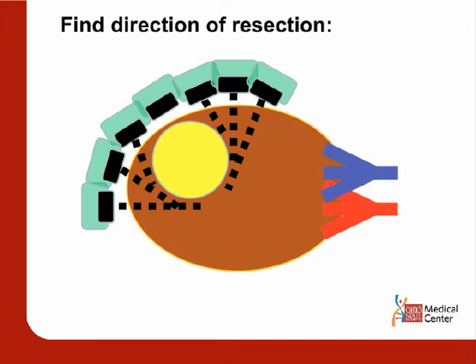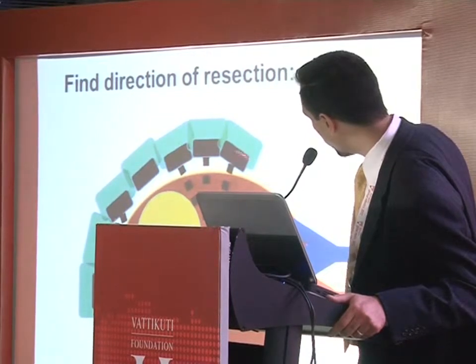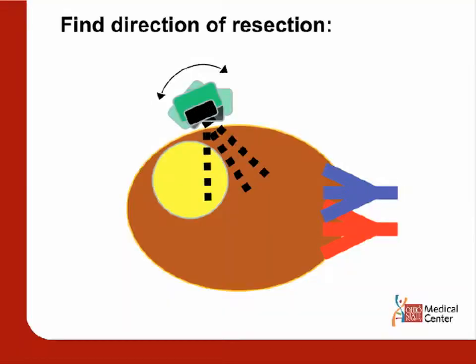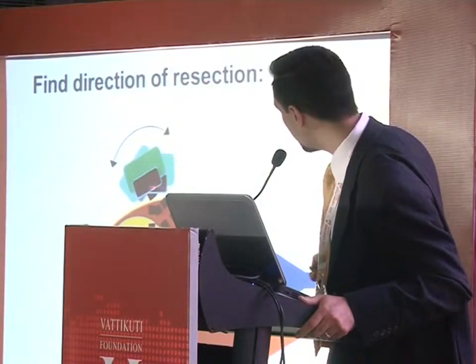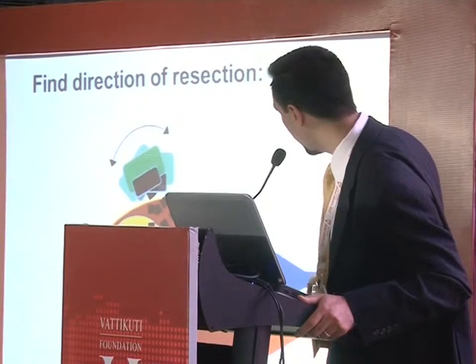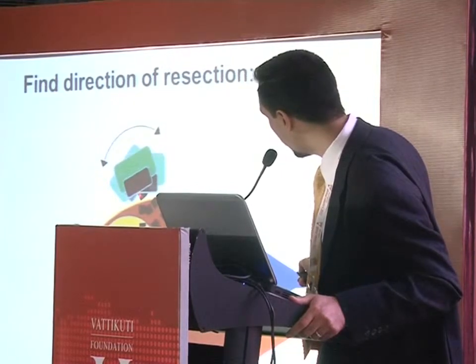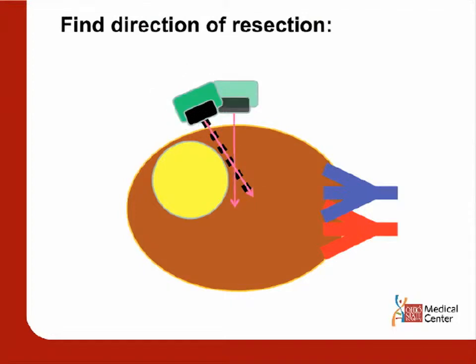So it's not just sweeping on the kidney — it's also rotating the probe. The idea is to angulate the probe to figure out which direction to cut. We could cut one way but we can save more kidney if we cut another way. When you combine sweeping and rotating, you can do a much more contoured resection and waste as little kidney as possible.